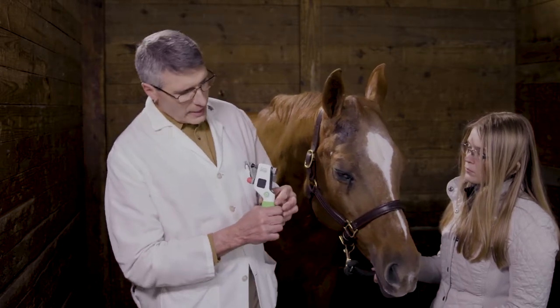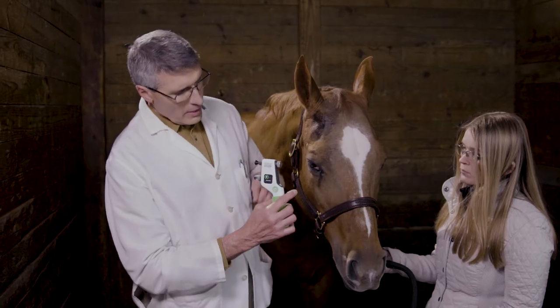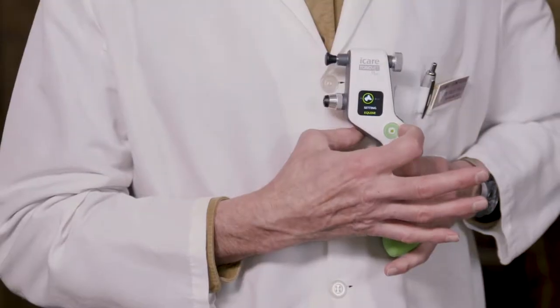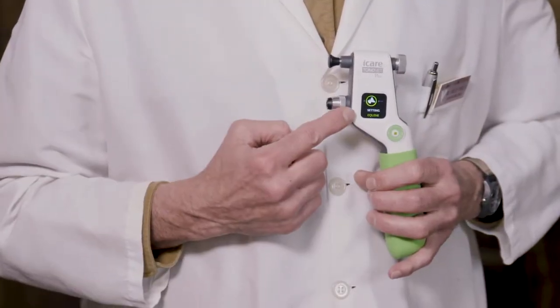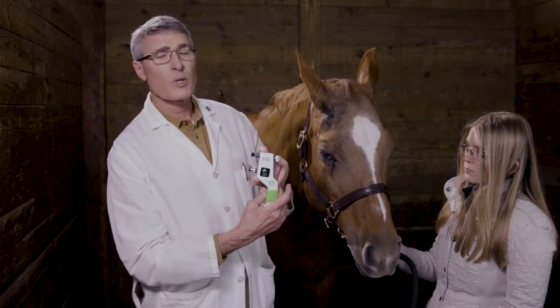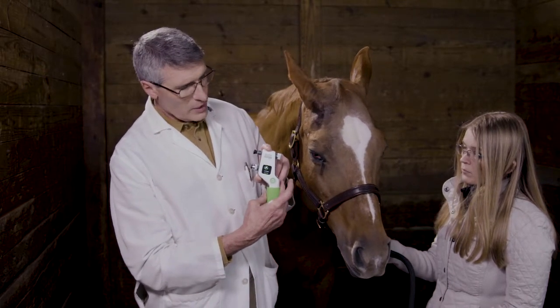Turn the instrument on and take off the little protective cover. We need to make sure that this is set up for the horse — we have it set up for the equine. This particular instrument is calibrated for four species: the horse, the dog, the cat, and rabbits. So here we've got the horse setting.